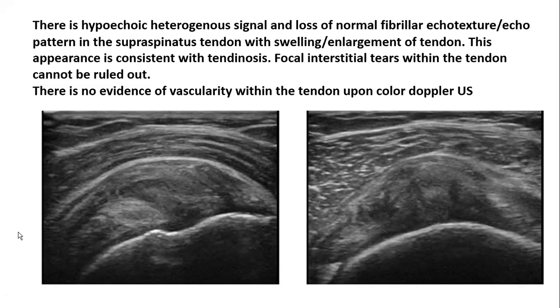So Mohini, you're saying that sometimes just the way to tell between the tendinosis and an actual tear is to look for the angiogenesis. Oh, no. Sorry. No. I'm just talking about all findings. No, with angiogenesis you cannot find the tear.